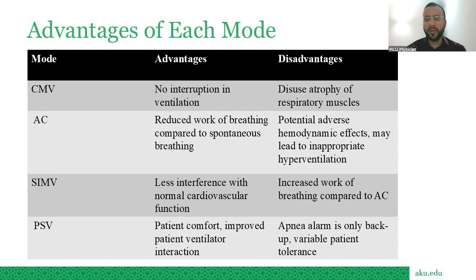Coming to SIMV mode, in which both breaths are independent and the patient can control his own breath, his own tidal volume, and the machine gives its own breath. Both go intermittent and both go synchronized.